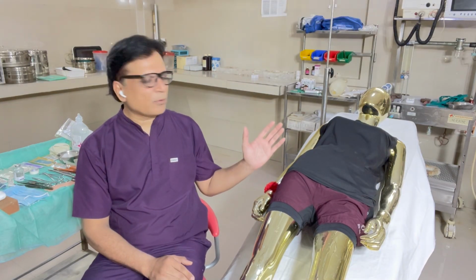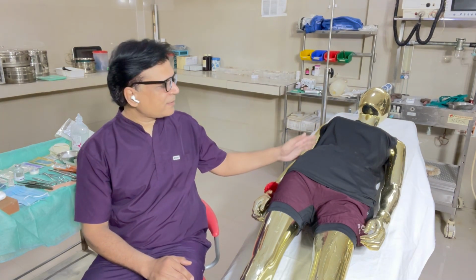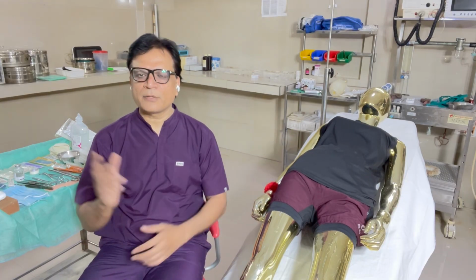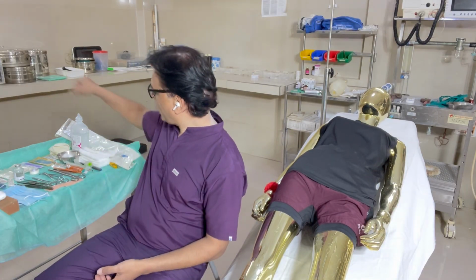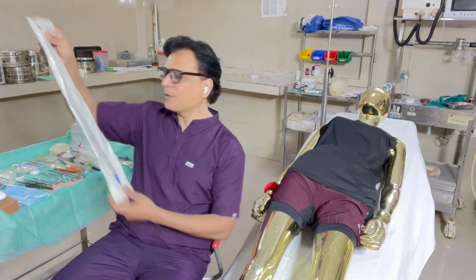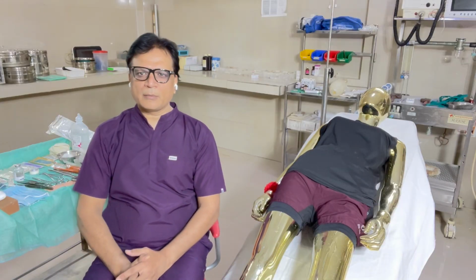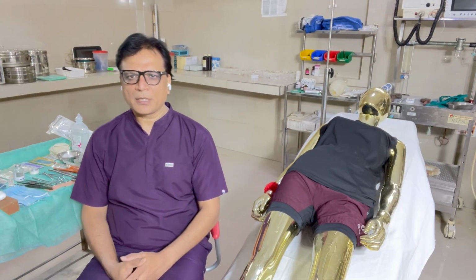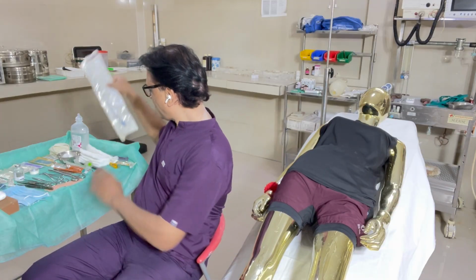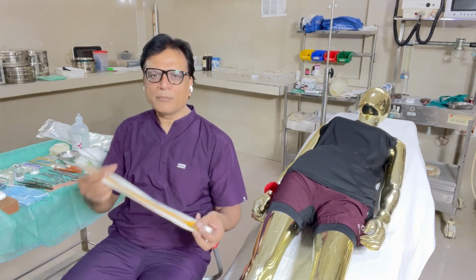Patient is having a road traffic accident, a pneumothorax on the right side or left side, any side can be given, a mannequin is there, and you have to demonstrate the insertion of the chest drain. So for that you need to understand about the chest drain and how it is inserted. And then there can be a case of a patient having retention of urine, and you have to go for catheterization. So these are the different instruments and the trolleys, the Foley's catheterization.